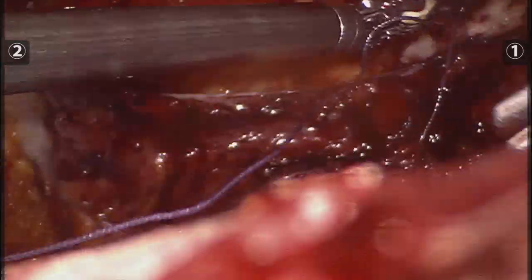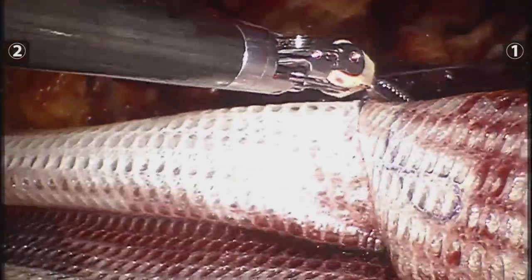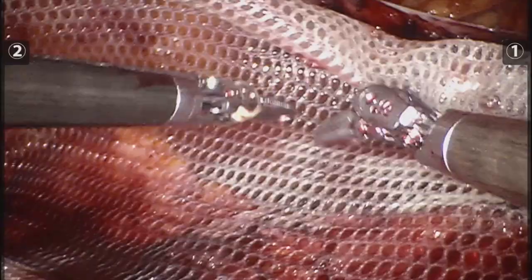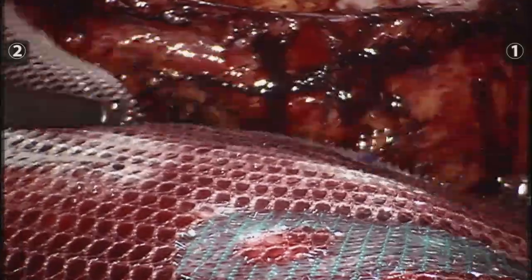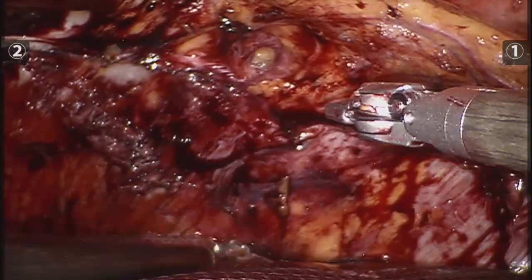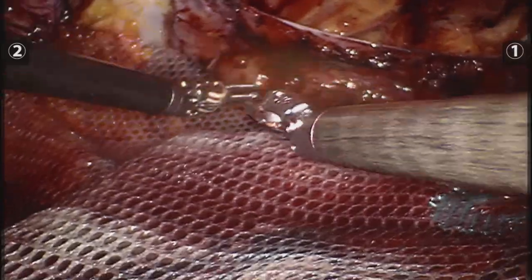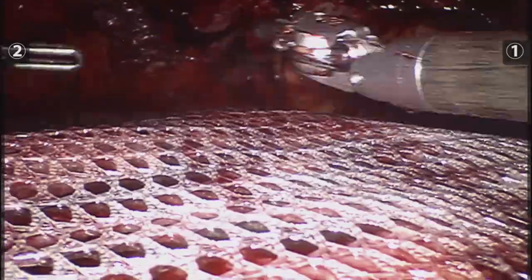Here we are finally unrolling the mesh inside the abdominal cavity. I've heard Dr. Conrad Ballester say over and over again that this is one of the most gratifying moments of the surgery, and I couldn't agree more — just seeing how that mesh lays flat on the posterior layer you just closed is wonderful, and that's when you get the feeling that things are finally coming together.